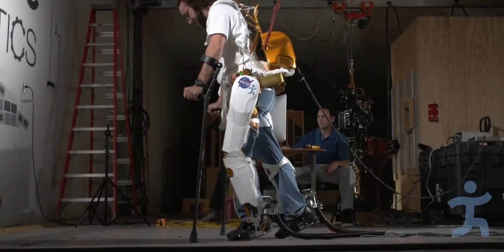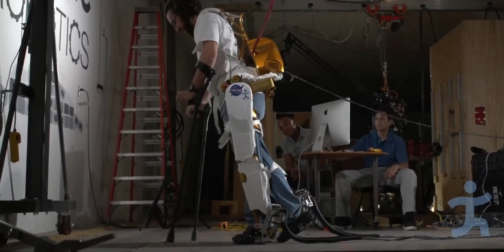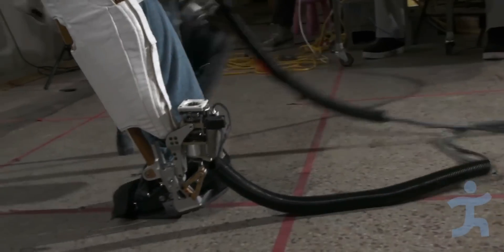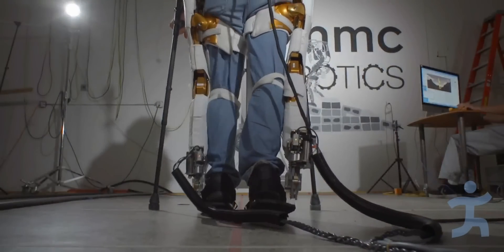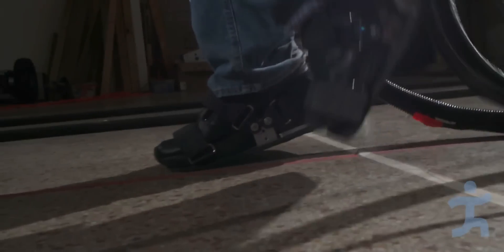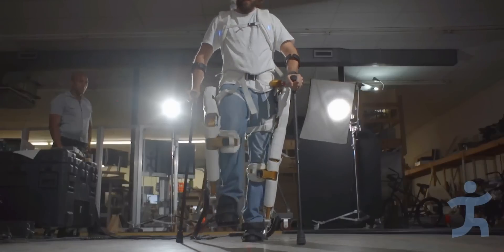The user walked in a straight line with the X-1 and the ankles powered, and then we turned off the power to the ankles and compared the two. The user reported that it felt more stable, it was easier to balance, and felt like the ankles were propelling them forward when in powered-on mode. This test is encouraging and reveals that adding a powered ankle to the exoskeleton does work.